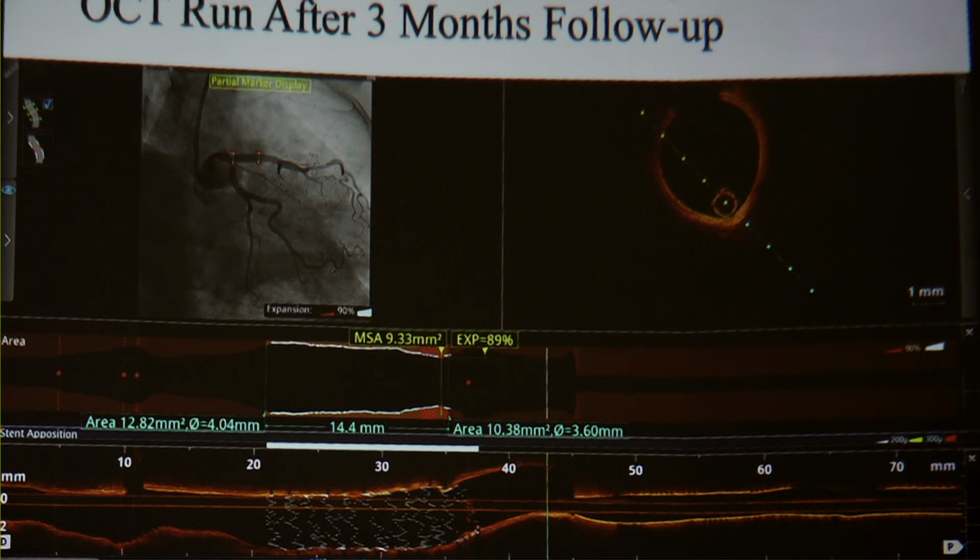Yes. One simple question: between the acute post-stent OCT and the 3-month OCT, it almost looks like the ostium was dilated again. The stent at the very ostium looks bigger, even though it's not a self-expanding stent. How do you explain that? I think it's the reabsorption of hematoma that has given way. I'm not sure. Do you see what I'm saying?